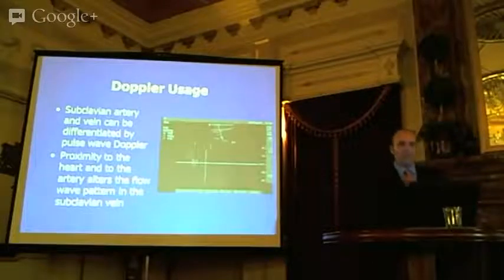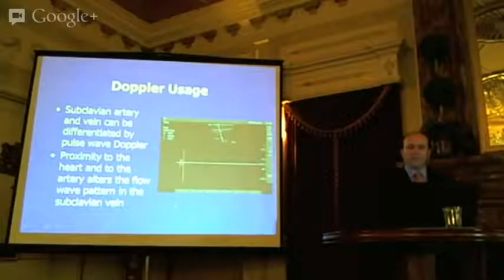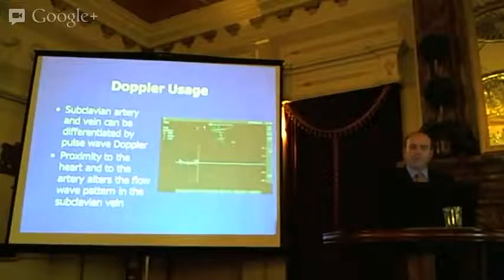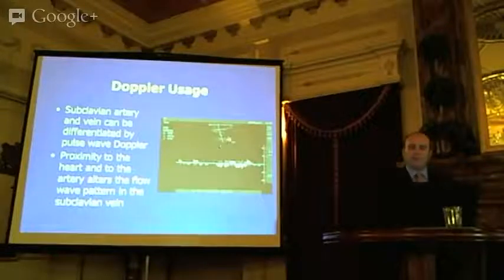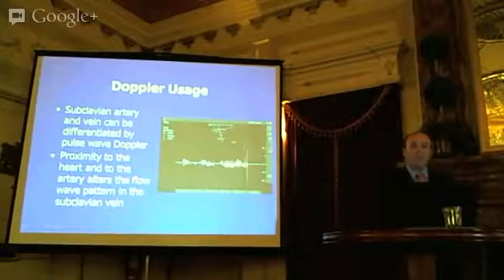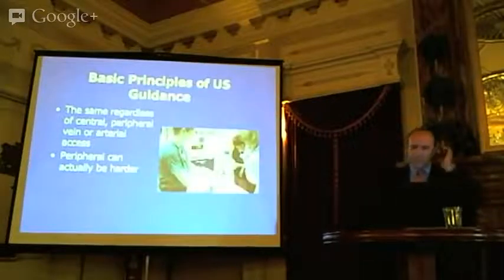This is a subclavian view. The artery and vein sit on top of each other occasionally. They seem to reverse position or sit next to each other. It can be very confusing. Everything is pulsing or pumping. It is very helpful in these cases to turn on some pulse wave Doppler and take a look at the vessel you're going to potentially cannulate. In this case, I don't know if you saw a valve in the vein briefly, but still helpful, differentiating from the other view we had, although very chaotic, not the type of venous waveform we're used to seeing. And this has definitely bailed me out of a number of trouble spots.